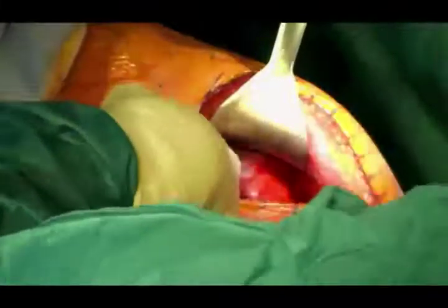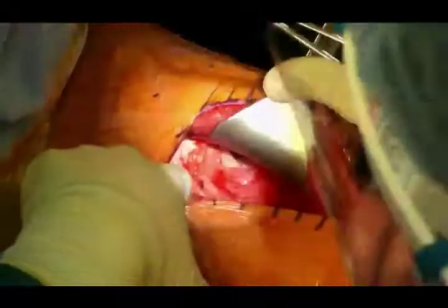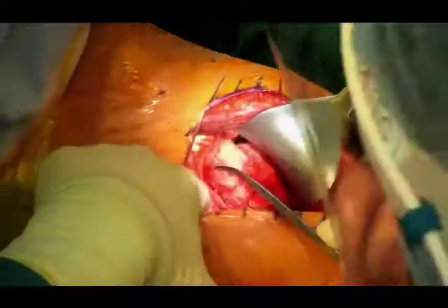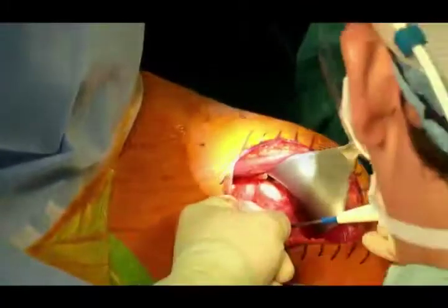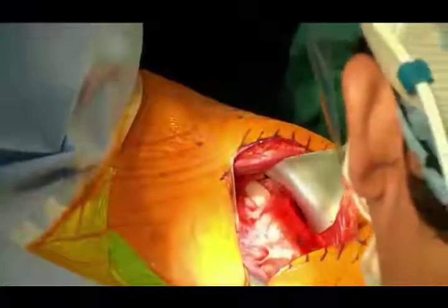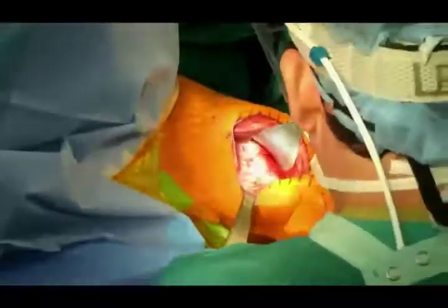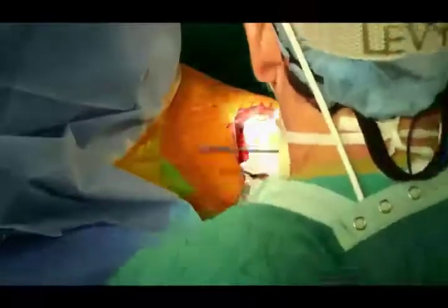I've developed my subdeltoid into my subacromial space. He's got no cuff, so the subacromial space is wide open once you remove the bursa. Now I have to develop my subcoracoid space. The trick is to find the coracoid. I slide a Schnitt retractor right under the base of the coracoid and underneath the conjoint to lever me forward. I clamp things to the drapes — something Dr. Frankel taught me nearly ten years ago when I did my fellowship.